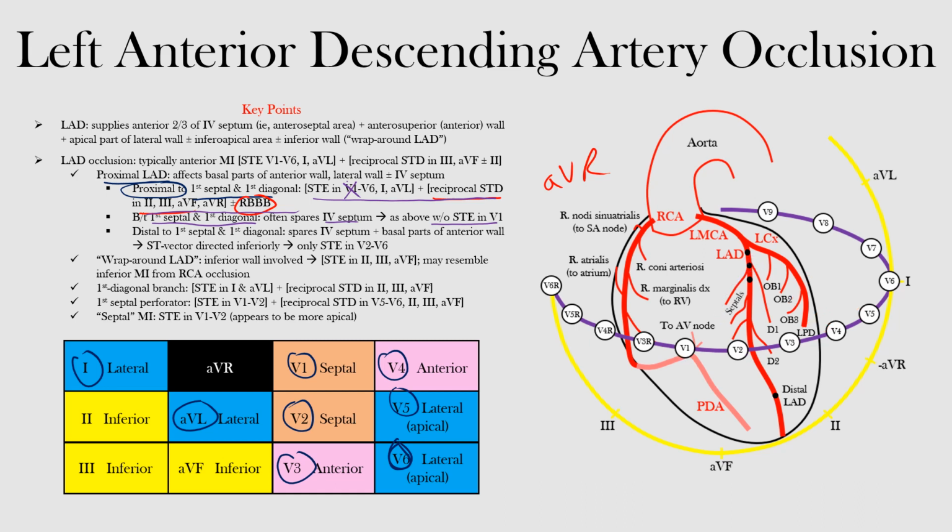Okay, now we're looking at that third dot in the artery, which is this one here. So we're getting more distal along the left anterior descending artery, and what we see here is as you're coming down, you're actually going to be coming more inferiorly. So now our vector is actually going to be going downwards, our ST vector into more of our inferior leads, okay?